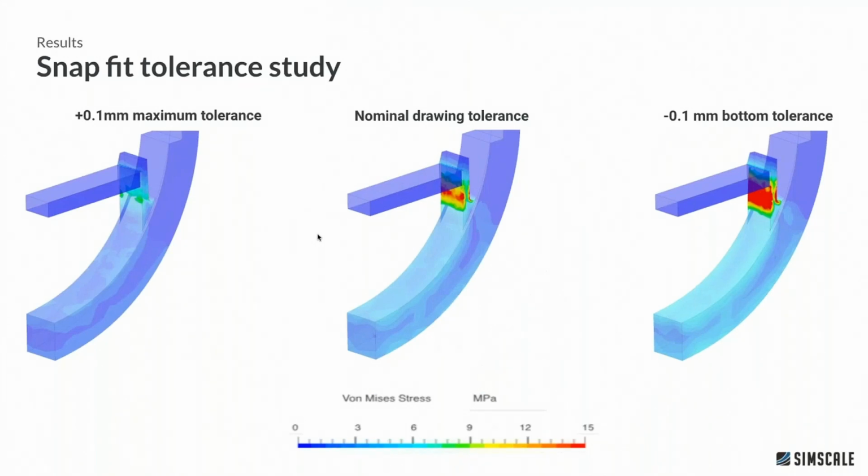at some results that we saw in the demonstration. So comparing all of these side by side, we can see with the maximum tolerance, the plus 0.1 millimeters, we've got very low stresses in the part, but critically, we might have too low a force required to break the snap apart, and we could have disassembly potentially. So it's really powerful, as I said, to be able to compare this and do these simulations without having to create a prototype and run physical bench tests. With the nominal drawing tolerance, this snap fit is performing as we would expect, and we would have obviously been able to hone this design using SimScale to get the optimal performance here.